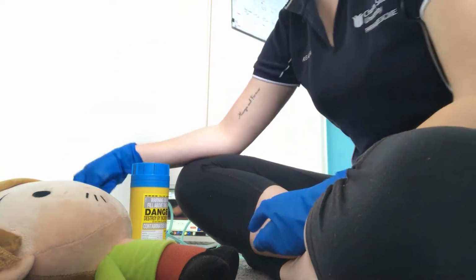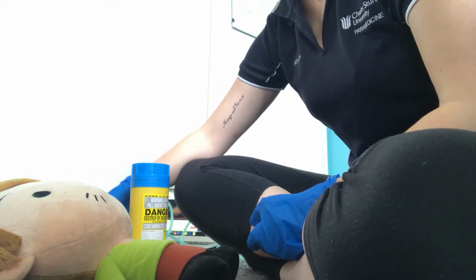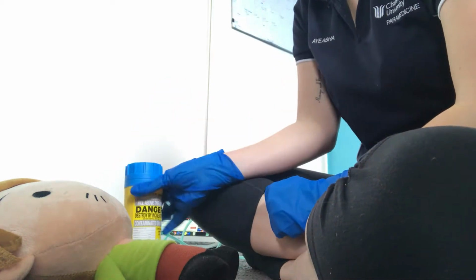So we've got our 14 gauge cannula, we have our one-way valve ready to go, we've got alcohol swabs, and we've got some tape for the one-way valve and to secure it all. And we also have a sharps container present.